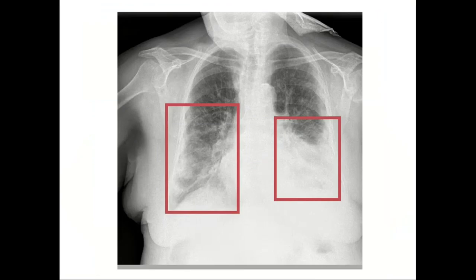In every object detection task, we must make sure that our model has a large enough receptive field to cover the largest object of interest. Here it was important to me that the receptive field of the latent feature map have the potential to cover the full lung area and full spine length.